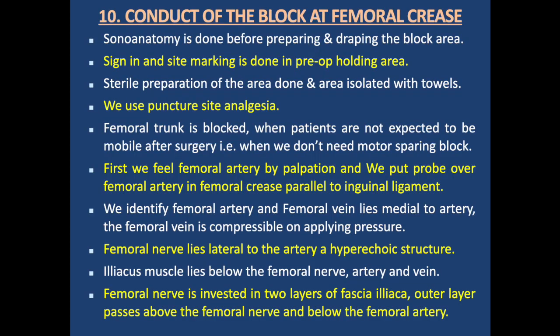Conduct of the block. Sonoanatomy is done before preparing and draping the block area. Sign-in and site marking is done in the pre-op holding area. Sterile preparation of the area is done and the area isolated with towels. We use puncture site analgesia.